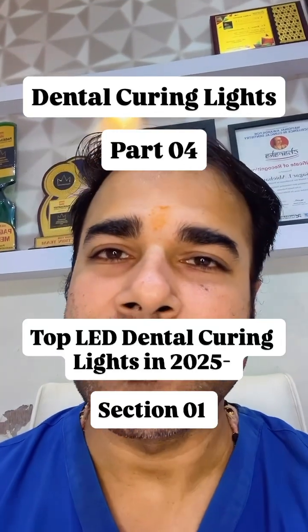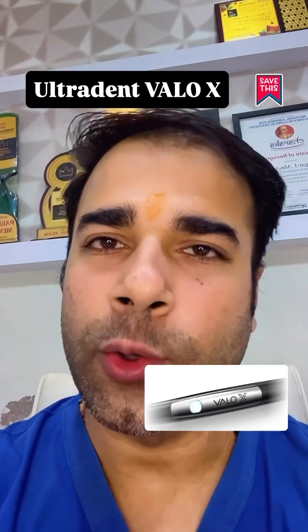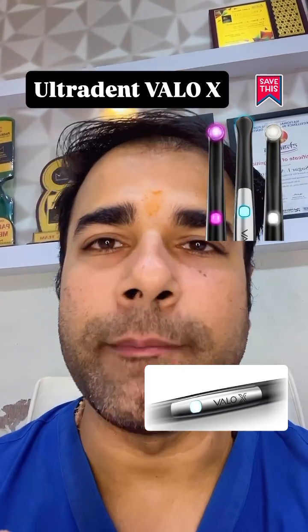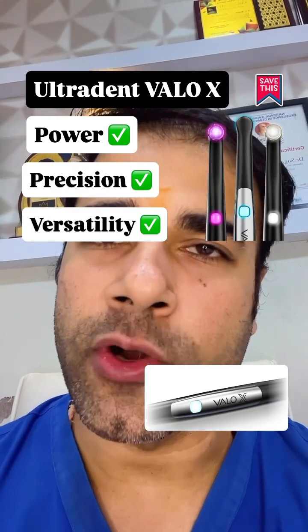Top LED Dental Curing Lights in 2025: the Ultradent Velo X. It sets a new benchmark in curing light technology, combining power, precision, and versatility in one sleek aluminium wand.